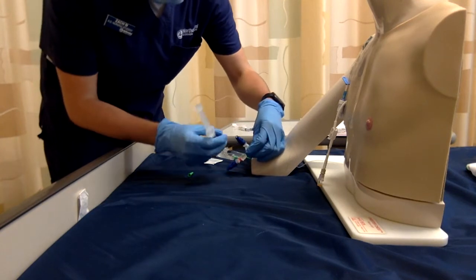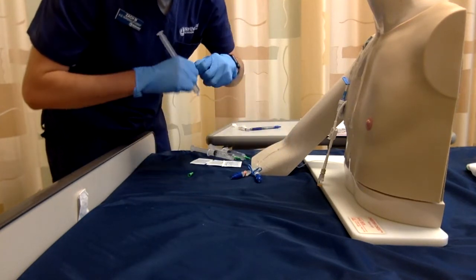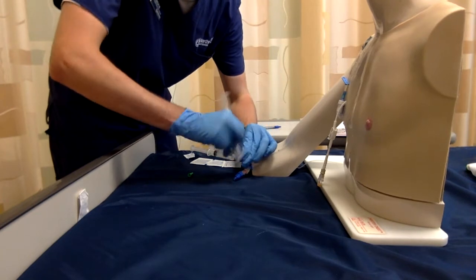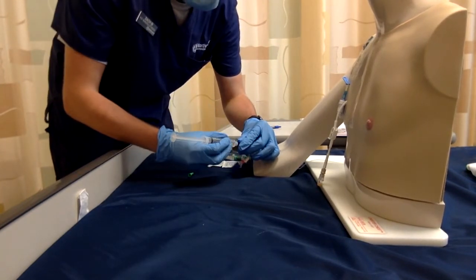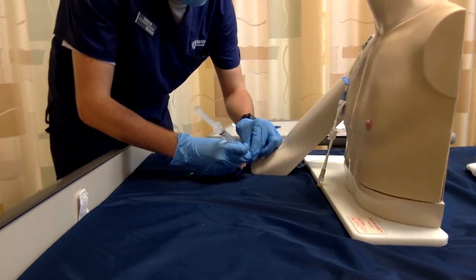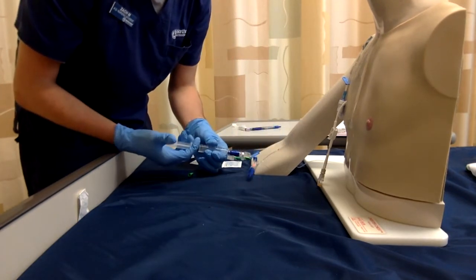I'm going to clean off my site, connect it to the tube, and then unclamp it. So now I'm going to flush it, and since it's a PICC, I'm going to be pulsating the flush.